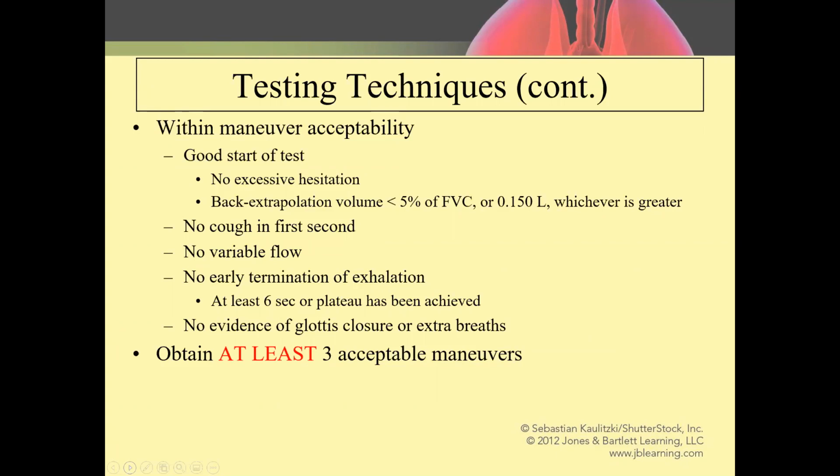Within maneuver acceptability: good start of the test, no excessive hesitation. Back extrapolation is one of the ways to really determine if it's a valid effort, if you will. No cough in the first second, no variable flow. And if there's early termination of the exam, instead of it coming down to a flat line very gradually, there'll be like a cutoff. And then obtaining at least 3 acceptable maneuvers, and taking the highest of those 3, by the way.